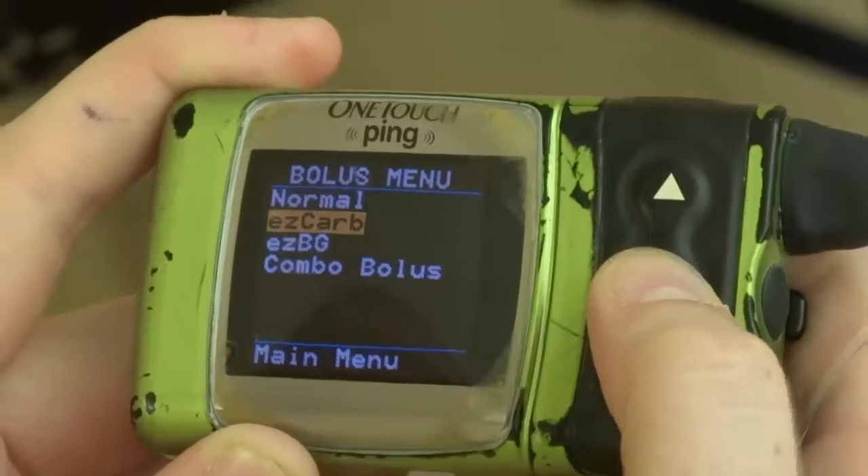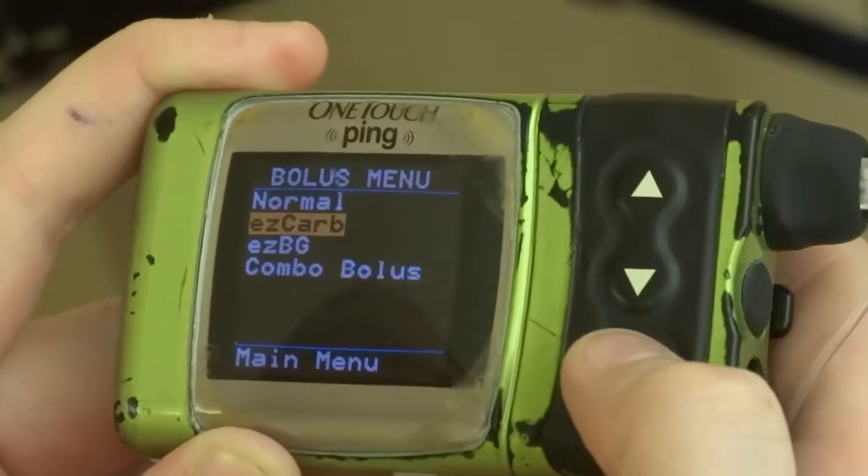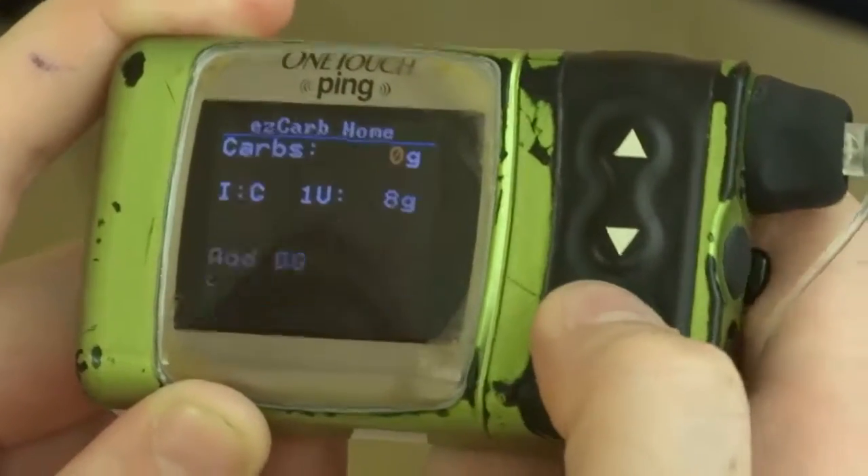Go down to Easy Carb — that's like a bolus wizard on the Medtronic pump. Go down and click on that.